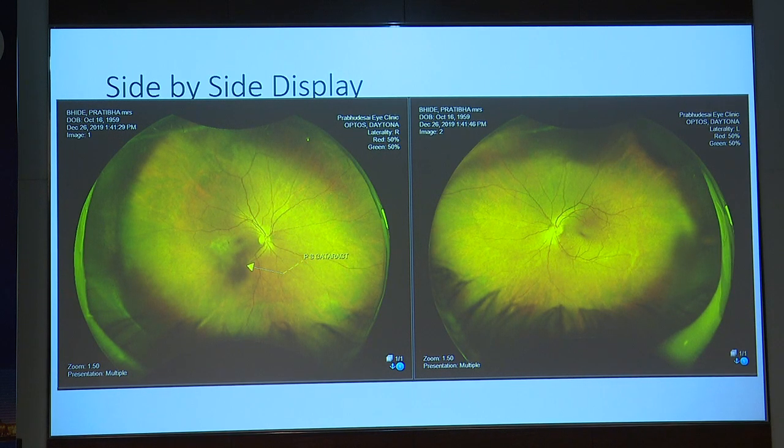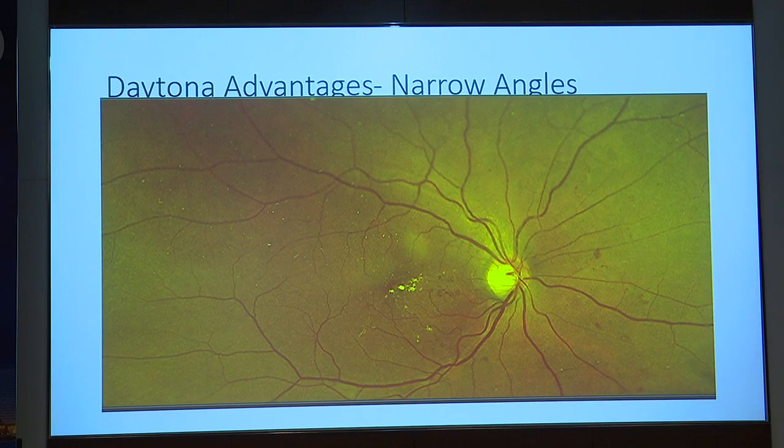As an additional finding, it helps in even documenting cataracts. So you can show the patient that we have done the imaging of both eyes, that is cataract, and even without pupillary dilatation, you can decide about cataract surgery.